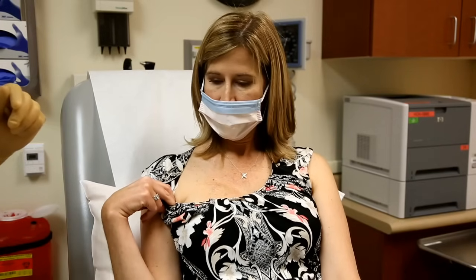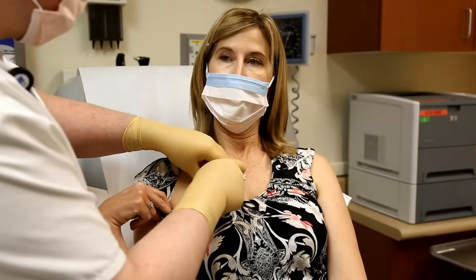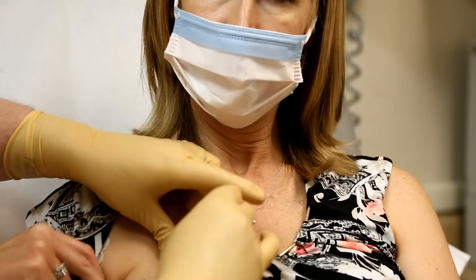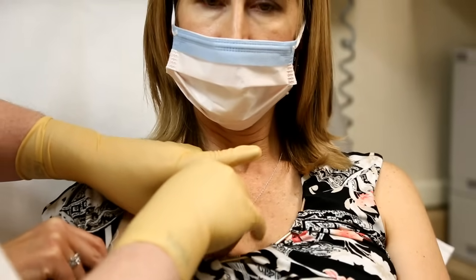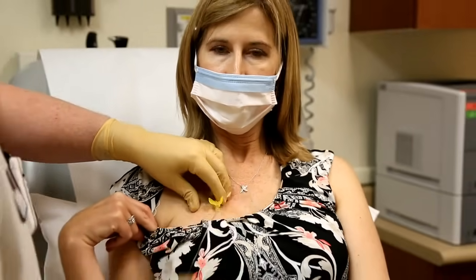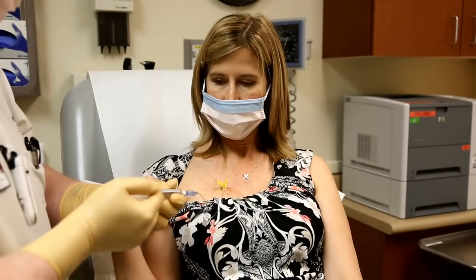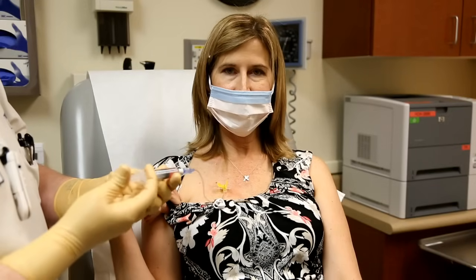We're just going to wait a second and let that dry. I'm just going to find the border of the port here so we know where we're poking before we poke. And one, two, three. I'm just going to flush here and check for blood return — that's working fantastic. I didn't even flinch, and I'm someone who does not like needles.